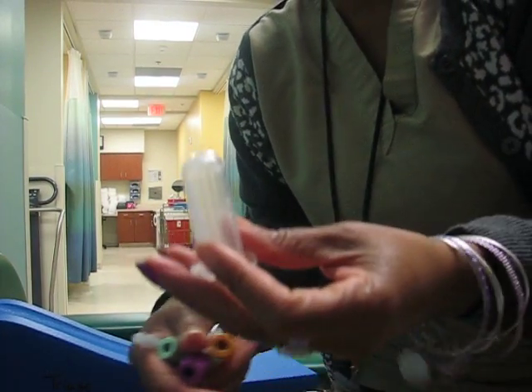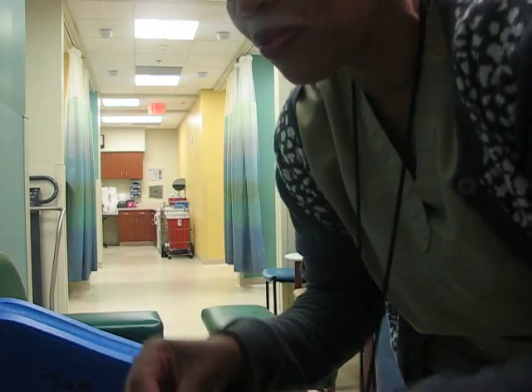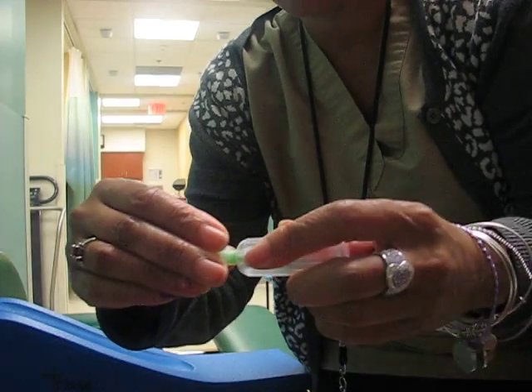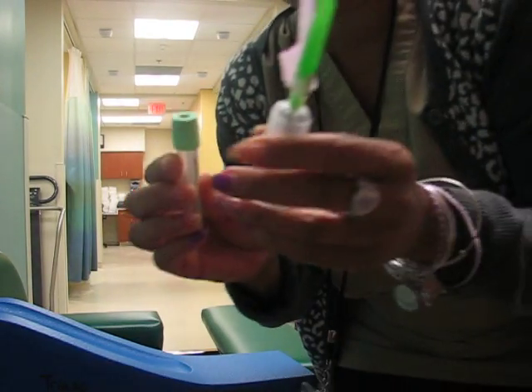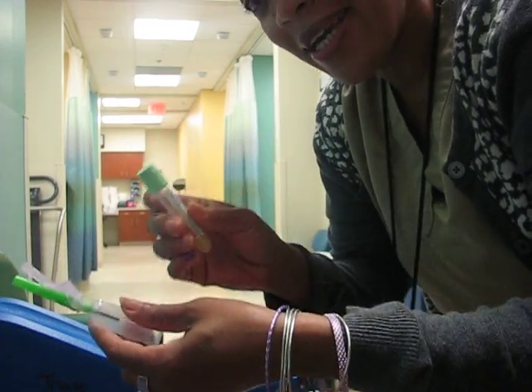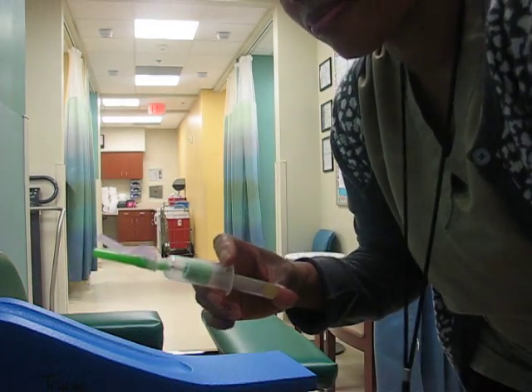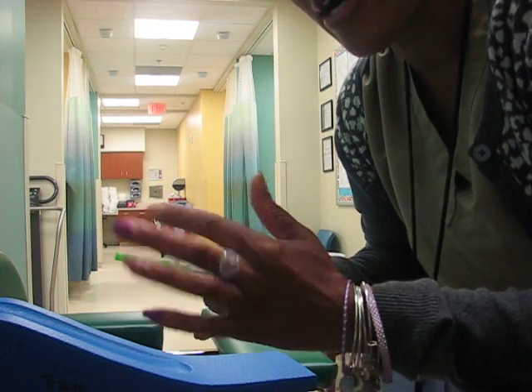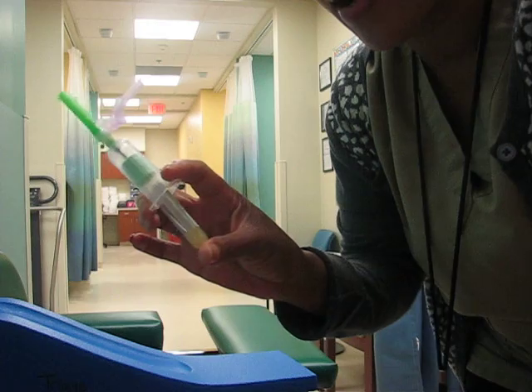So this of course is your vacutainer holder. You've got your needle — we're going to put the needle in the holder with a twisty motion. We're going to pretend we are going to stick. I place my tube in the holder, I release my safety device, and I pull the cap off. This is how I have my needle.